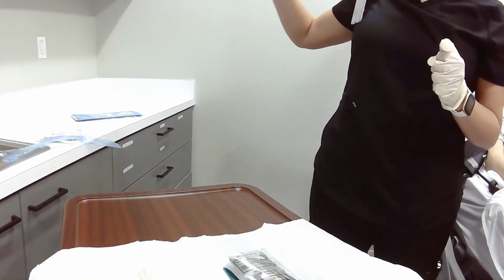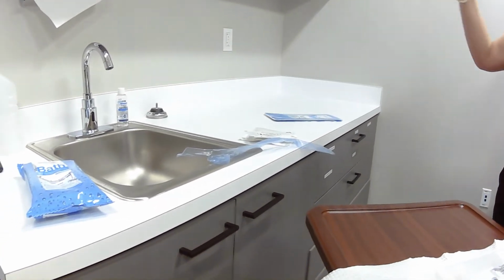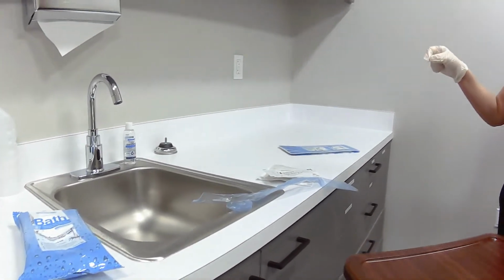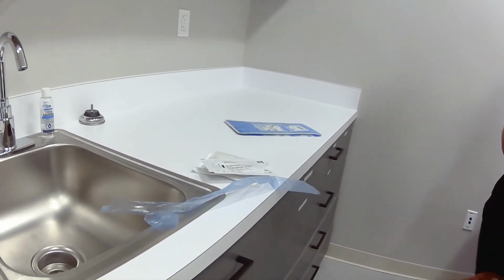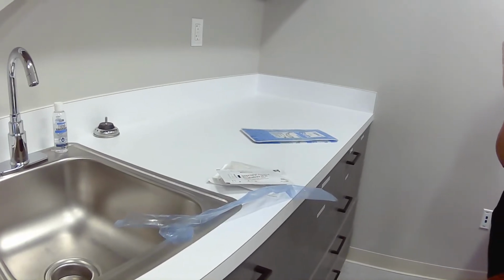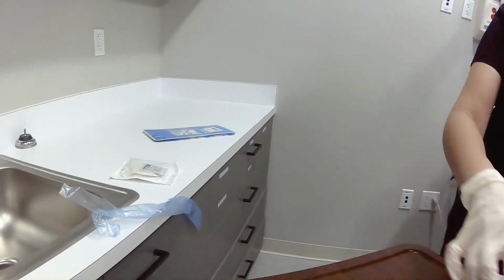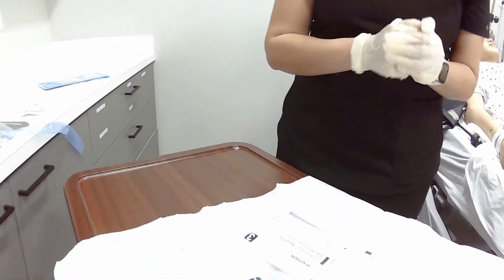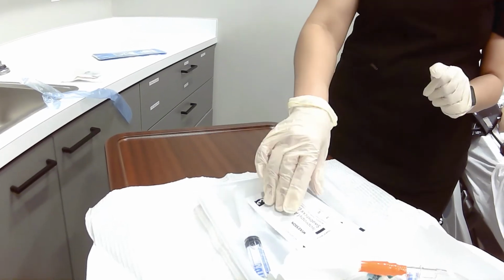In this case, we are going to have our swab sticks. Our swab sticks are going to be non-sterile. So we would have somebody to help us to open it and then drop them into our kit. But for these purposes only, what we will do is we will pretend that this is in our kit. So I'm bringing it over to my kit and we'll pretend that it was already in the kit.